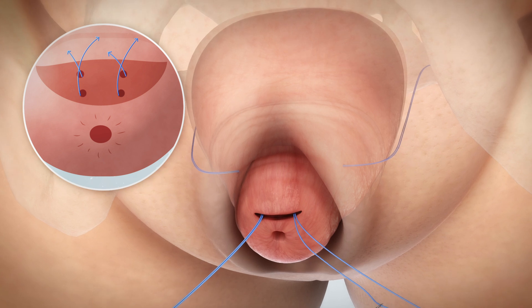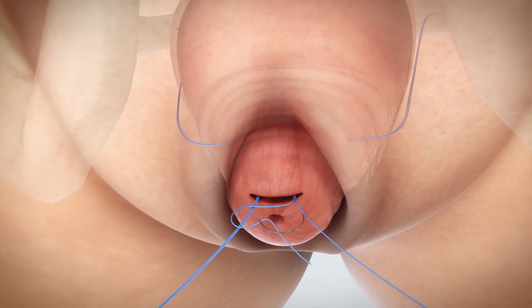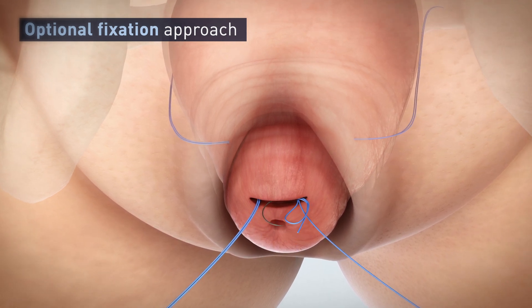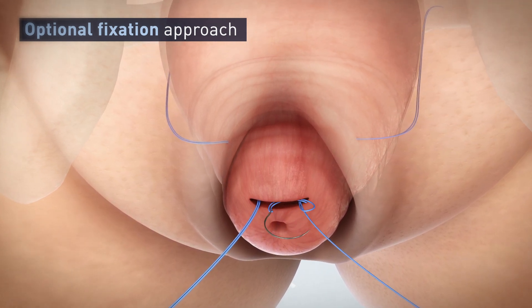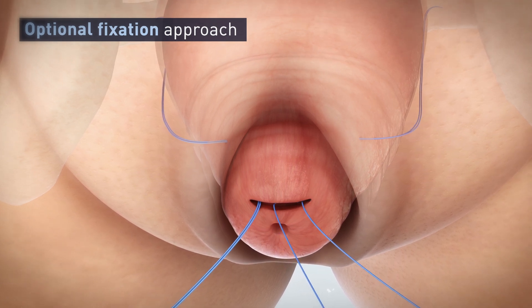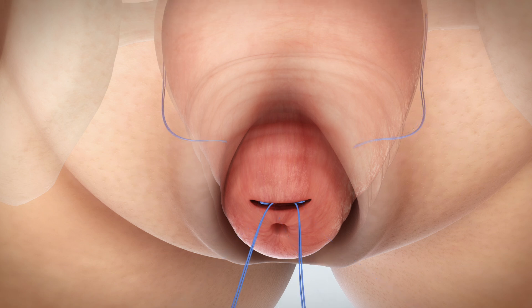Some surgeons opt to bring two sutures through the stroma with a single pass. If this approach is utilized, it is important to make a significant purchase of cervical tissue lateral to medial with at least one of the tails on each side to create a stronger fixation in the stroma. Repeat this action for each of the suture tails as needed.